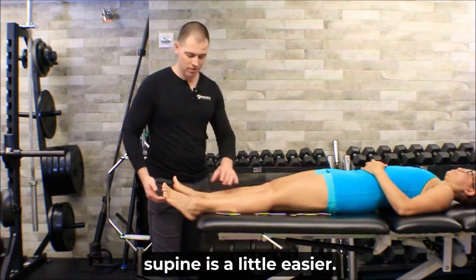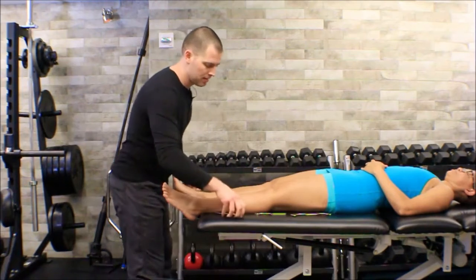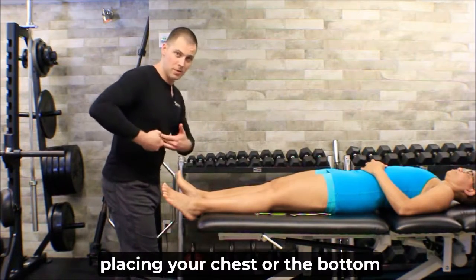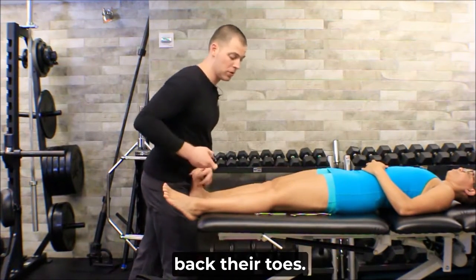Supine is a little easier, so you're going to have them pull up their foot as you pin, pull up their foot as you pin, and then of course you can add overpressure by placing your chest or the bottom of your rib cage over the top of their foot and pulling back their toes.